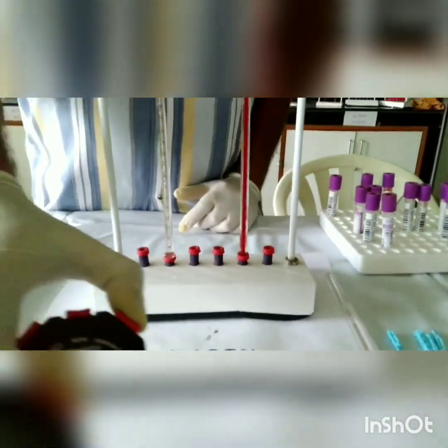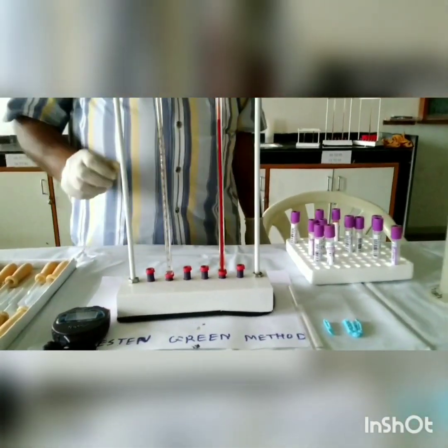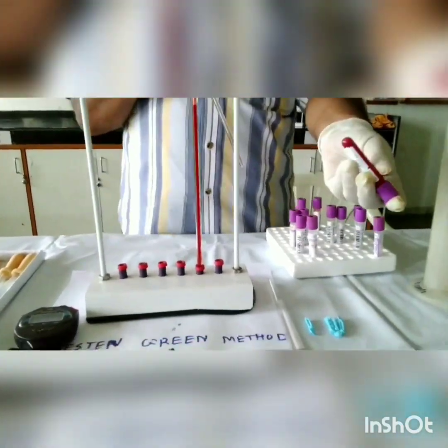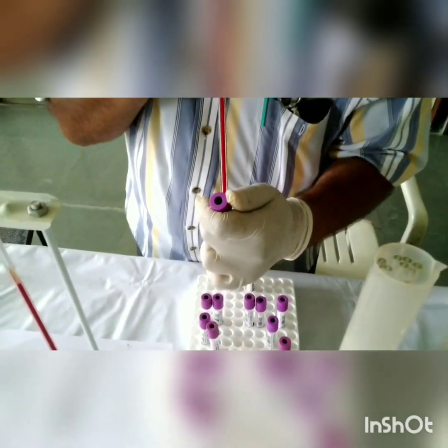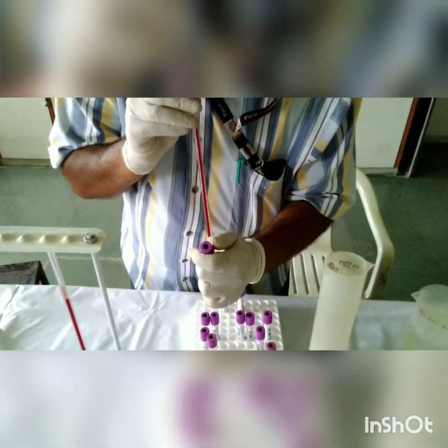Then carefully put the filled tube on the pad of the Westergren stand. While putting the tube, your index finger must be tightly pressed on the Westergren tube to avoid blood leakage from the bottom side. Firmly press the bottom of the tube on the pad of the Westergren stand. Then slip the upper end of the tube under the screw cap of the stand and note the time.